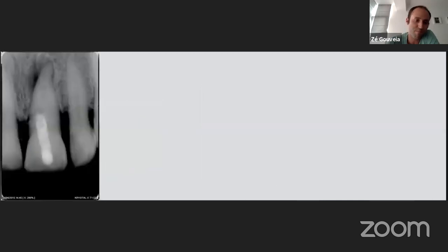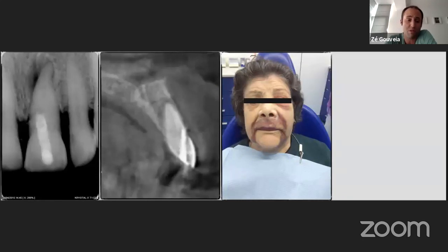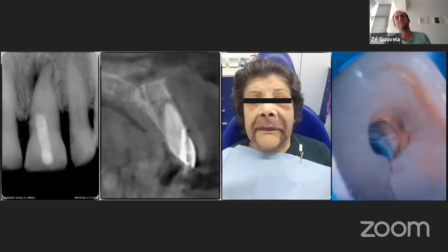like this. This is one example where we can see that a false path while approaching this calcified upper incisor led to a perforation, as seen on the CBCT slice, leading to a sodium hypochlorite accident, ending unfortunately in extraction due to a non-restorable fracture of the tooth, due to the big and invasive destruction caused by the wrong access.